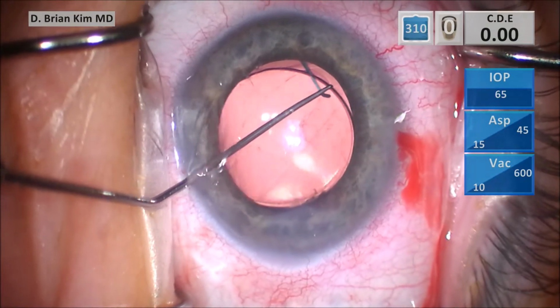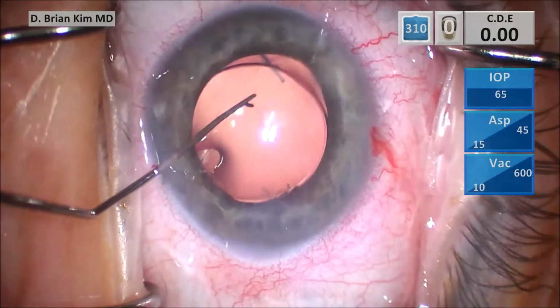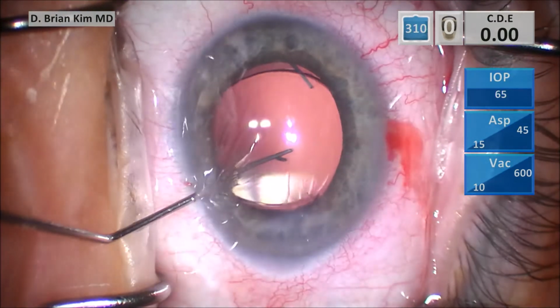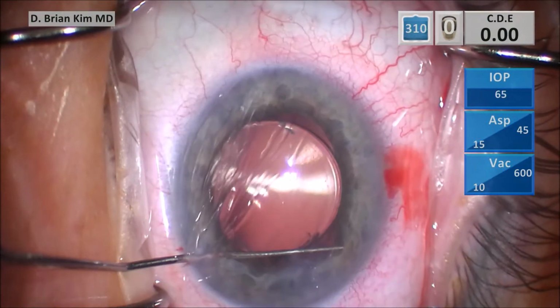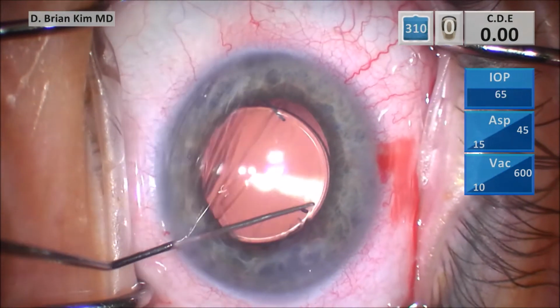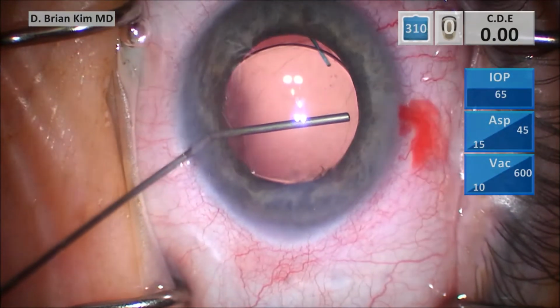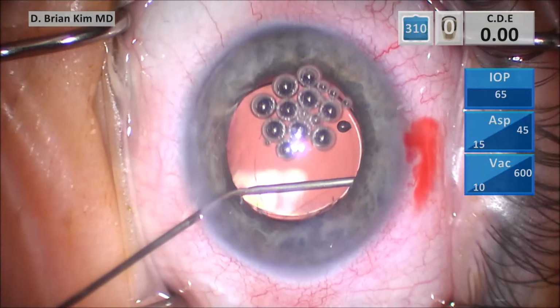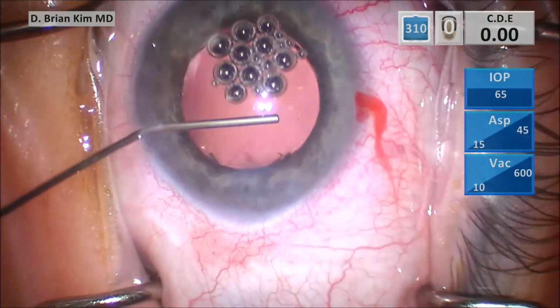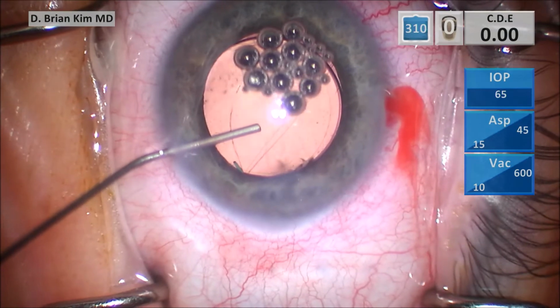I'm trying to assess how well the anterior capsule is going to be able to hold this optic. One thing I'm noticing is there's an asymmetric overlap to the anterior capsule around the optic here. And so I'm trying to figure out why that is. So I go in with the BSS cannula and just trying to tease the anterior capsule off the posterior capsule here. What I suspect is that there's a little bit of fusion of the anterior and posterior capsules on this temporal side of the capsular bag here.